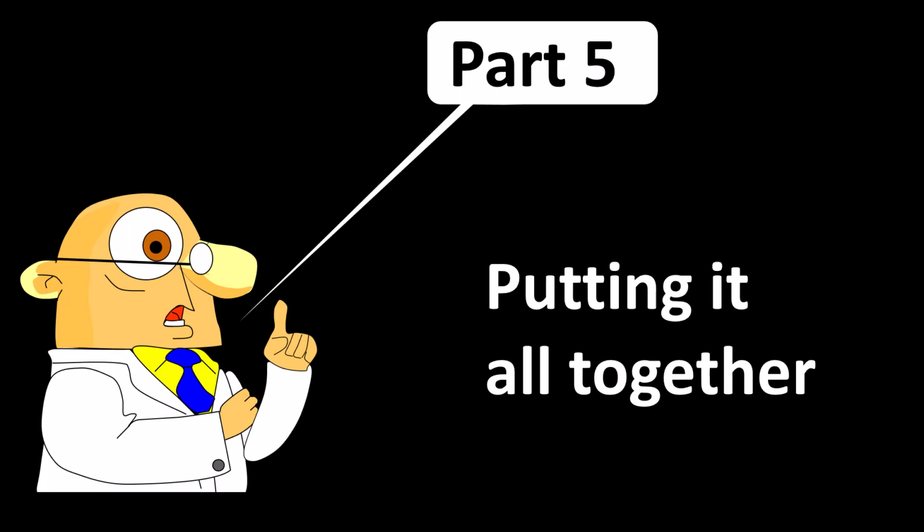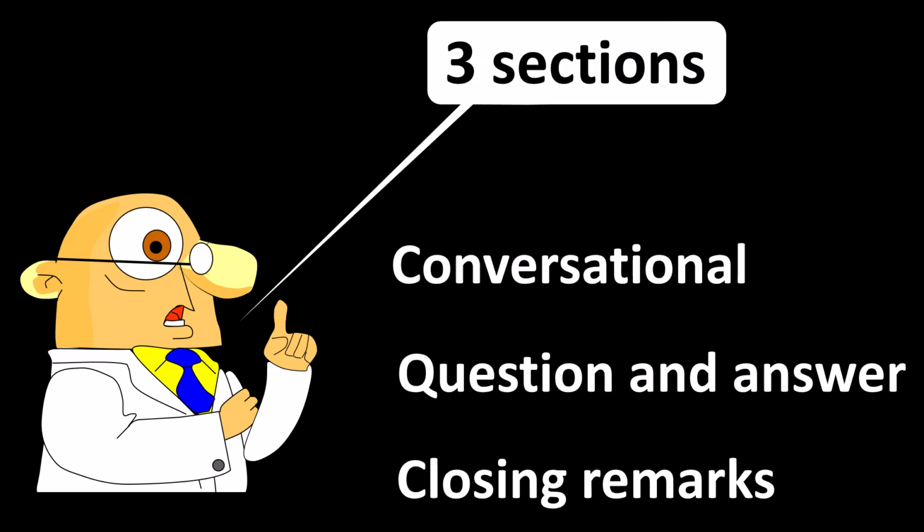This lecture is intended for Nicklaus Children's Hospital Clinical Neurophysiology Fellows. It is the last of a 5-part series about EEG montages. It is helpful if this lecture is viewed after the first 4 lectures on the subject. This talk will be conducted initially in a conversation format, later in a question and answer format, and at the end I will make some closing remarks.